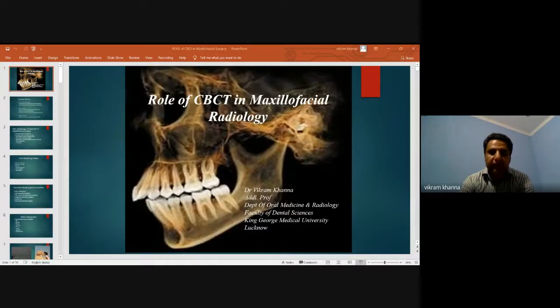Of the dentoalveolar and non-dentoalveolar pathologies, and you will definitely develop a skill to see how to systematically analyze the CBCT images, what the radiological signs of pathologies are, and how to go about reading reports that can be communicated with all diagnostic information. You can even get a judgment with high accuracy of how the pathologies are and how they are behaving, if they are aggressive or chronic in nature. So everything we are going to deal with.